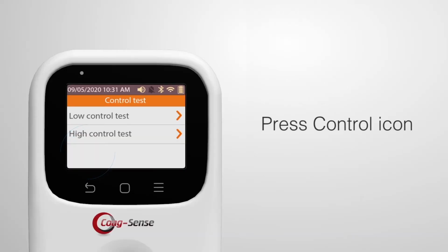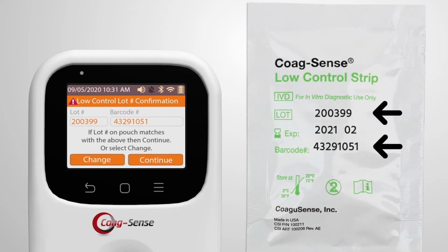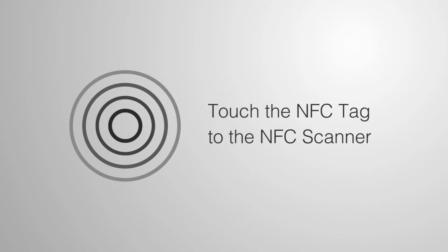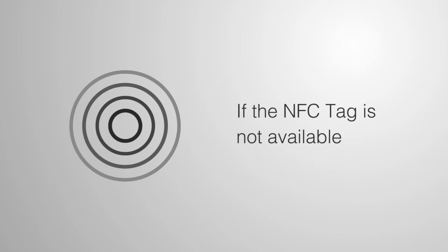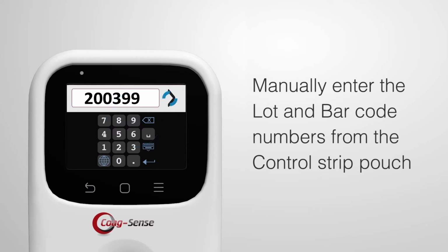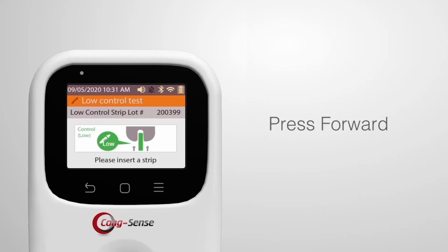Press the control icon on the display. Select from the following 2 options as applicable: low control test or high control test. Confirm that the control strip lot number display matches the lot number on the test strip pouch. Then press Continue. If the number does not match or the field in the meter is blank, then touch the NFC tag to the NFC scanner on the meter. If the NFC tag is not available, then manually enter the lot and barcode numbers from the control strip pouch. Then press the Forward button.